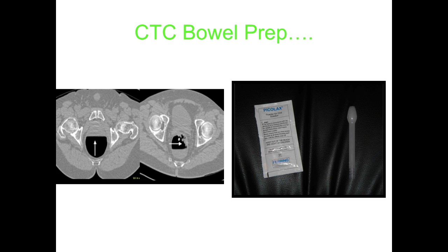Here's an example of why we need both supine and prone views. In the prone view you can see a little fluid, and the colonic wall looks clean — it's difficult to see anything there. But when you turn the patient over, you encounter a lesion — that's a tumour. You need to see both sides of the colon wall, hence you need both positions. We used to use Picolax and a rectal catheter, but now it's completely changed with an automated insufflator and gastrographin.